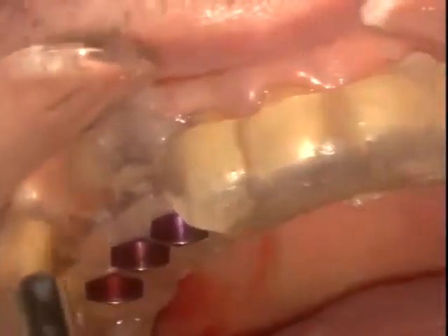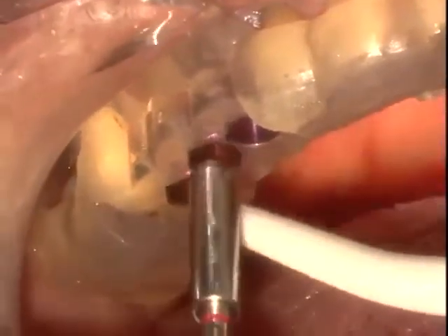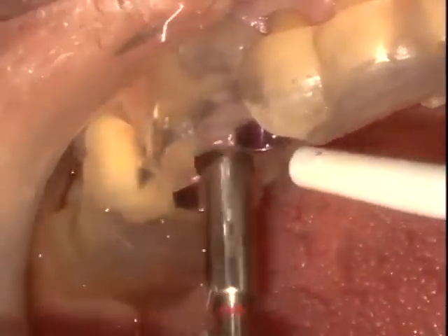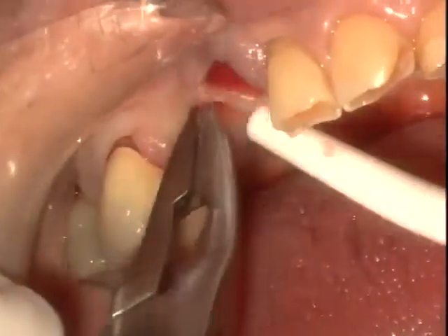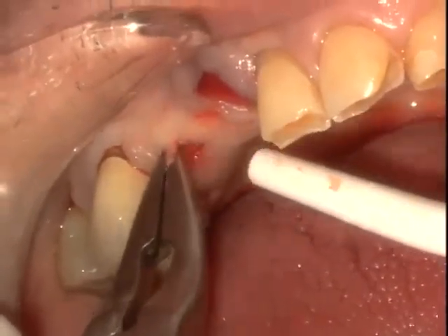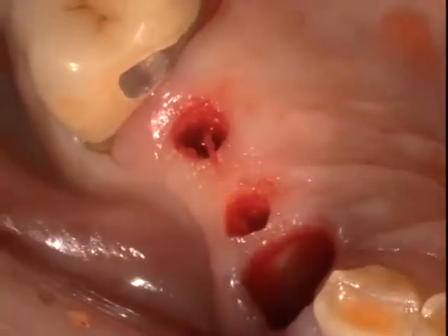This guide has been fabricated off of two scans that have been combined, the optical scan of the teeth as well as the digital scan of the cone beam image. With precise fitting of a tooth-borne surgical guide, I can now go ahead and utilize a trephine to access the soft tissue. So we're going to remove the soft tissue utilizing tissue punches that were accessed through the surgical guide. I'm using a rondure just simply to remove the soft tissue adhesions that have been left behind to make sure that we completely now have access to the ridge form.